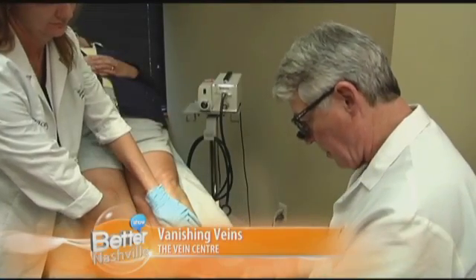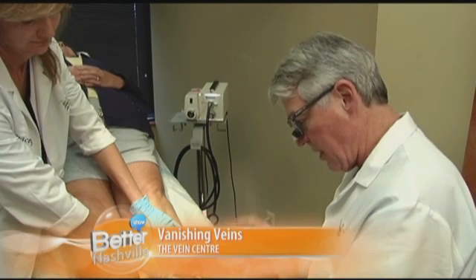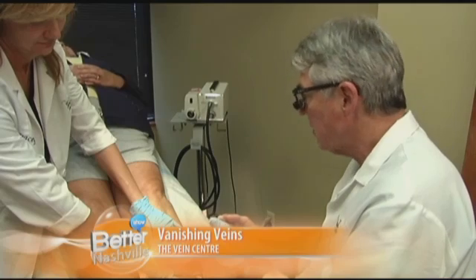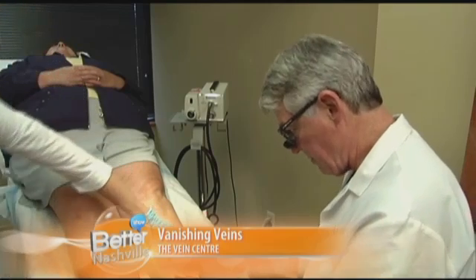All right, let's go ahead and put a wrap on that. We put kind of a pressure dressing on it now because we want to continue to have contact between the sclerosing agent and the vein walls, because what we're trying to do is make this thing scar shut, clot shut, and let her body absorb it. So we'll see her back in about 4 to 6 weeks and see how things are going.